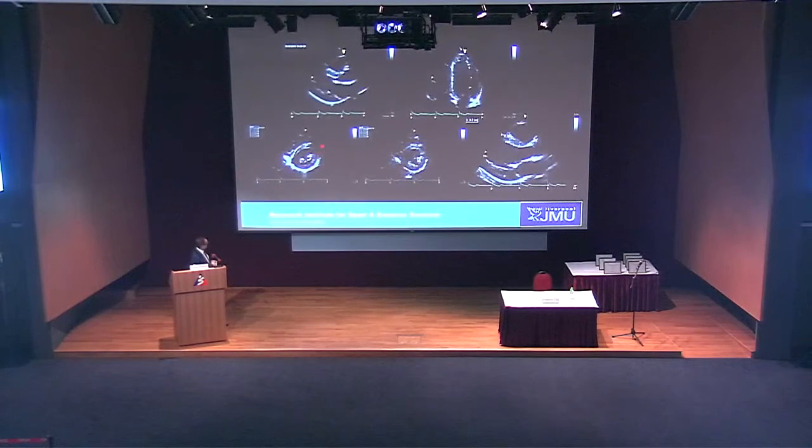Wall thicknesses. The basal septum, I don't know if you can see this here, this is 13 millimeters. In a black athlete, they say it should go as high as 14 millimeters. But it's not the same all the way around. In fact, 12 down here, 10 here, mid-level quite normal. His cavity is 61 millimeters. Now, this wouldn't be a hypertrophic cardiomyopathy because surely that's always a small cavity. It's a small cavity and increased thickness.